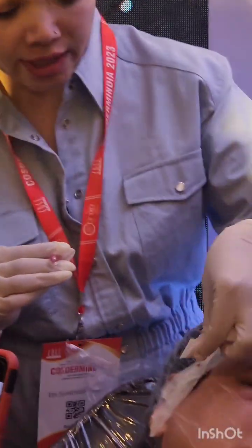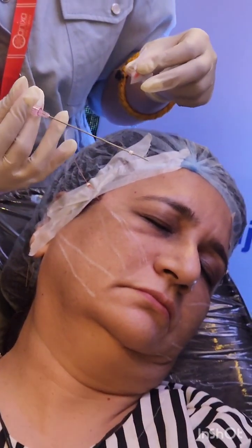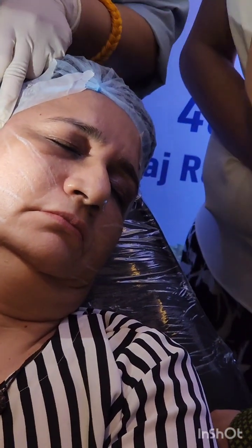Again, don't touch the needle, that will make the area unsterile, right? So again, I'm sterilizing it. Can somebody show me light here? I can't see if the hair is going inside or what is happening. The light should be lower.